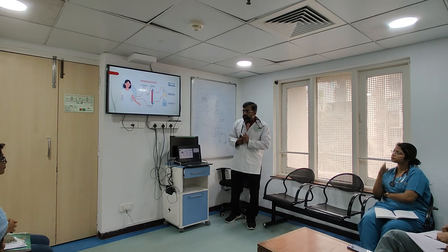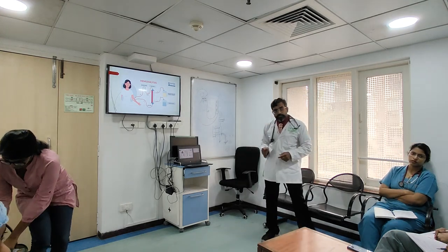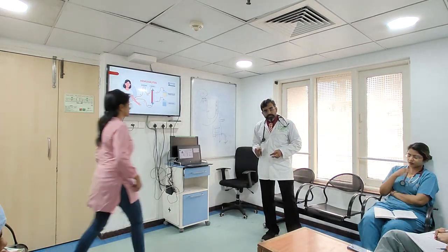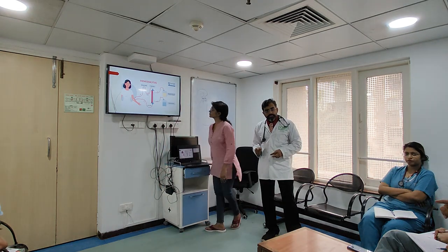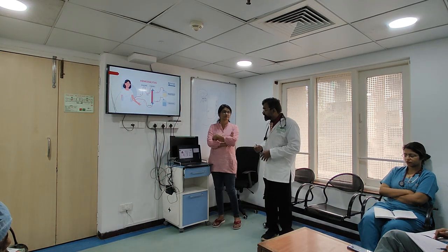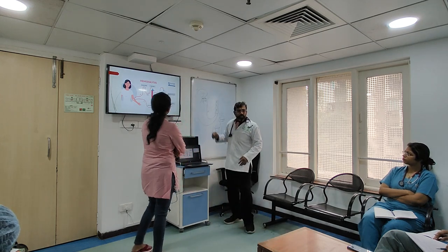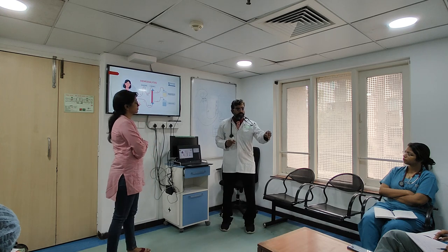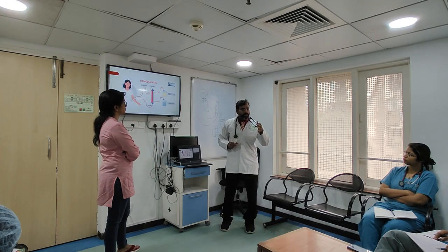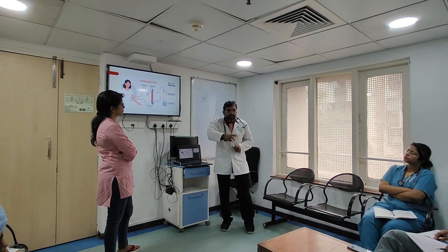You're understanding? So if the access is not good, or the lumen of the catheter is small, that pressure will get more and more negative, no? So you have to figure out whether it is this pressure or that pressure. Both the pressures, one is pushing, one is pulling. You understand? Now it is important that you cannot just change the lumens.